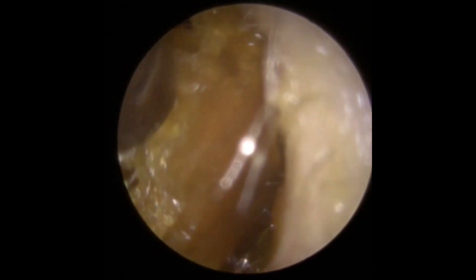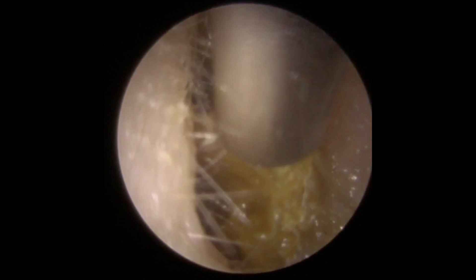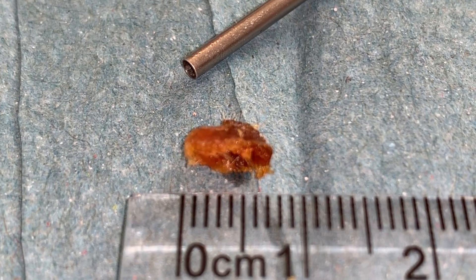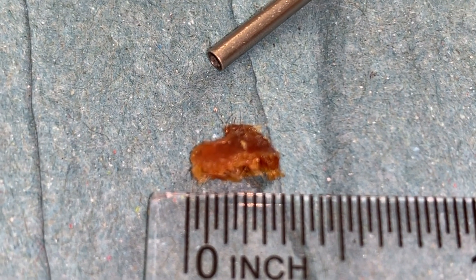You can see it's all starting to move really quickly now because the olive oil has worked its way down the side. It's all come away — that literally was a couple of sprays of olive oil in the ear canal and then back in with the suction tube. It works that quickly in some cases. It got a bit stuck at the entrance to the canal, gave it a bit of a wiggle to get it out. And out it pops. Have a good look at the eardrum — looking nice and healthy behind. The piece of wax removed looks huge on the screen, but the eardrum is only about roughly a centimetre across, so it's very, very small.